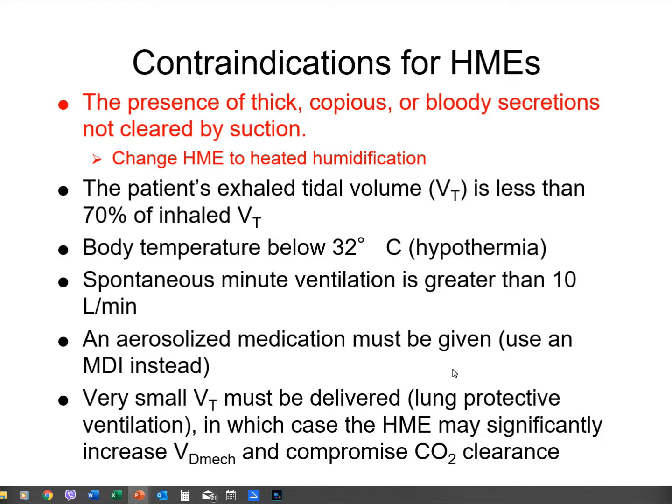Again here, and I've touched this before, presence of thick, copious, or bloody secretions not cleared by suction. If they're just too thick, don't put the HME. Again, it says right here, change HME to heated humidification. That's the main concept here in terms of contraindications, because you can clog up that HME. It says that if aerosolized medication must be given, use an MDI instead.